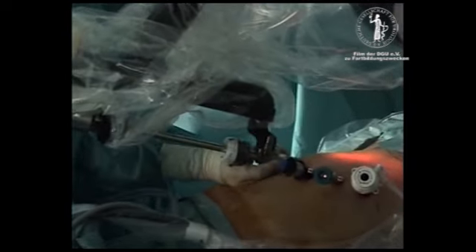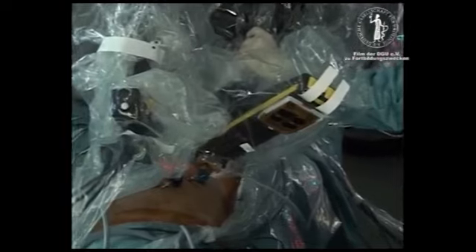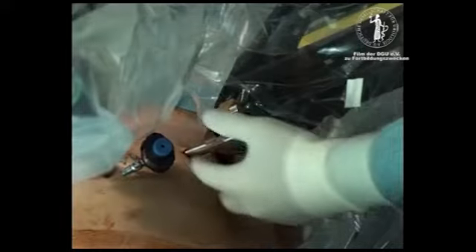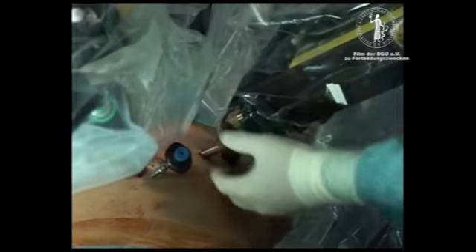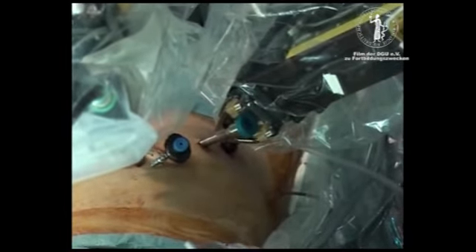The robotic arms are swung down to the robotic trocars and attached using the screw fittings. The correct placement of the trocar in the abdominal wall is controlled and corrected if necessary. The same again on the left side.